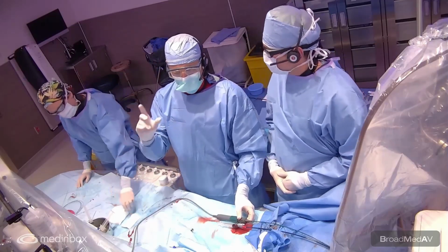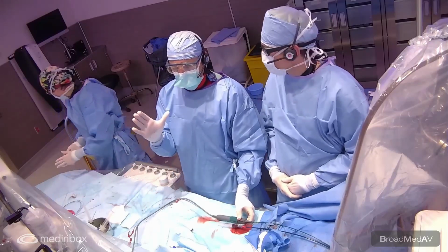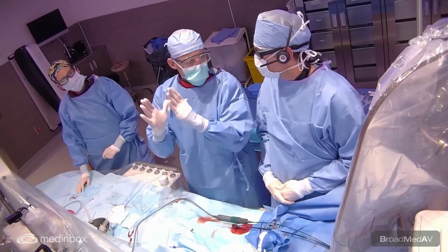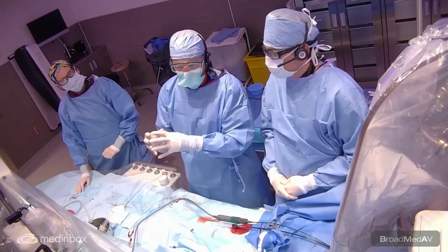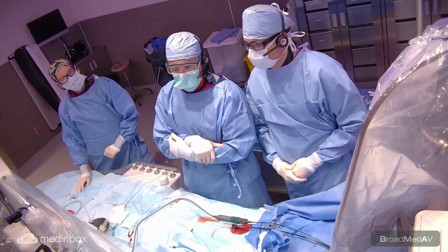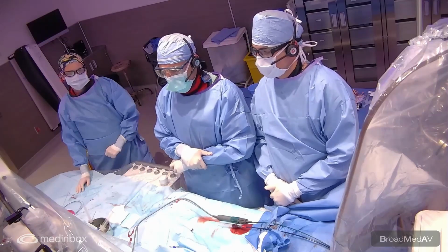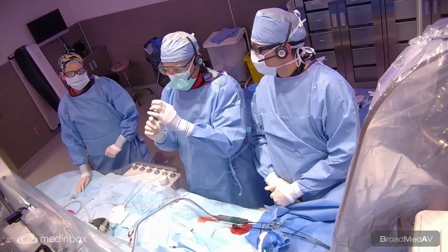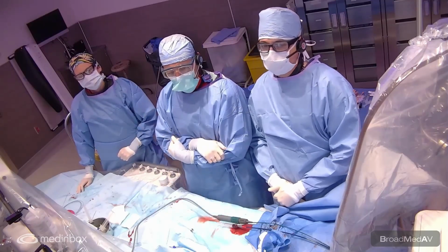In my experience, a very aneurysmal septum like this one can be very challenging because if you put a device, especially a device with only two discs, like a PFO occluder, it tends to not be stable. But by putting a device like this, what we call an atrial septal occluder, which stents the middle portion of the septum, the device tends to be more stable. And this is exactly what we saw today. Despite it being a PFO, we chose to close with a septal occluder, a device designed to close an atrial septal defect, so a hole in the heart instead of a tunnel.